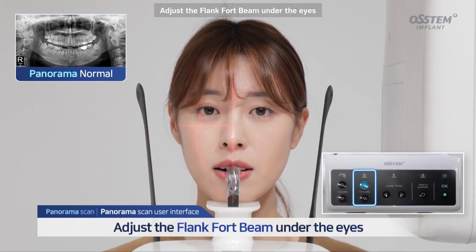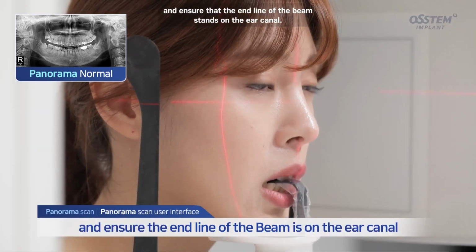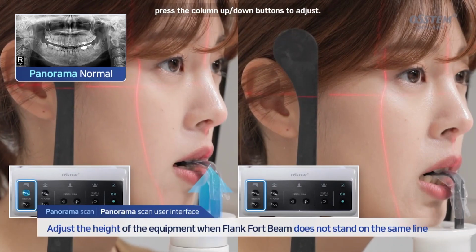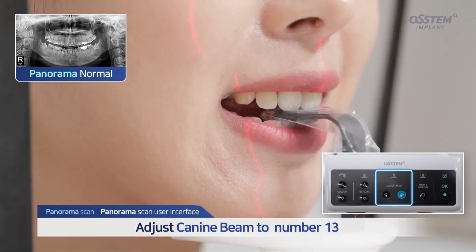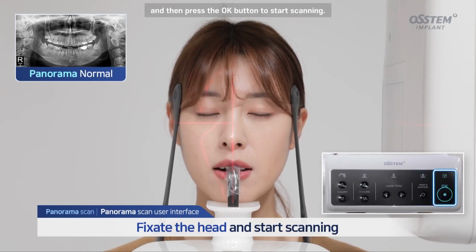Adjust the Frankfort beam under the eyes, and ensure that the end line of the beam stands on the ear canal. If the Frankfort beam is not on the same line, press the column up-down buttons to adjust. Place the canine beam on the number 13 teeth. Press the temple support button to fixate the patient's head, and then press the OK button to start scanning.